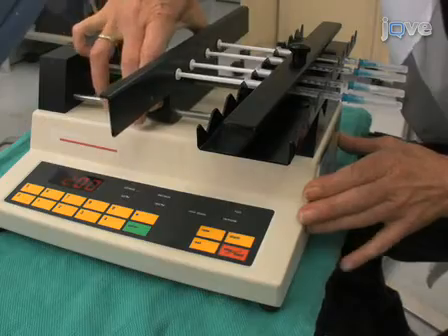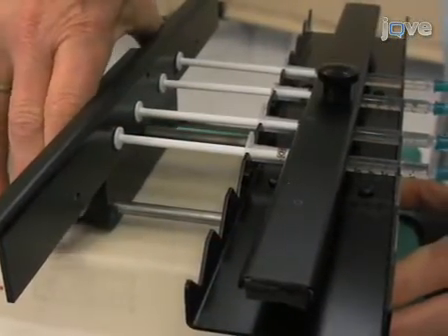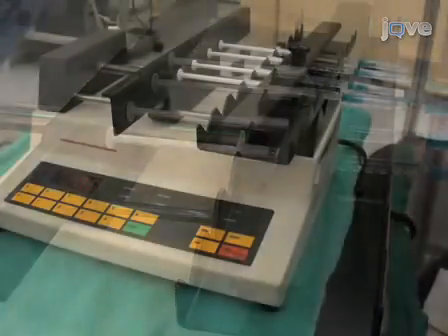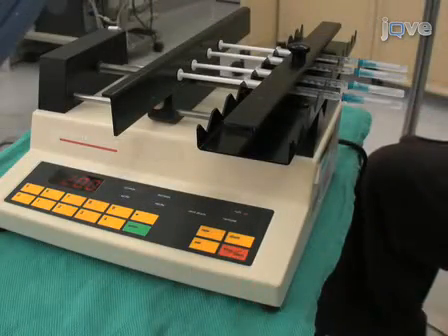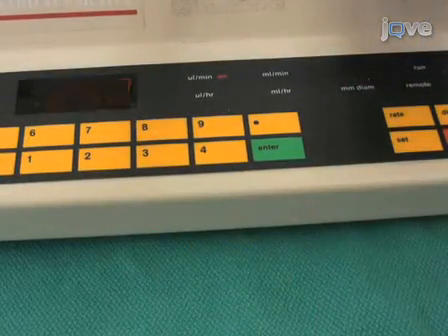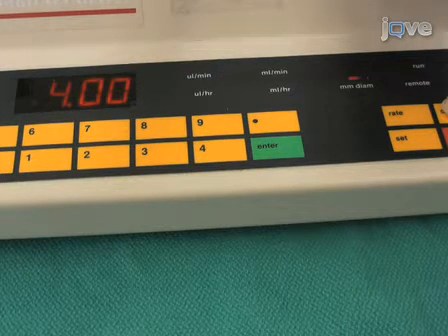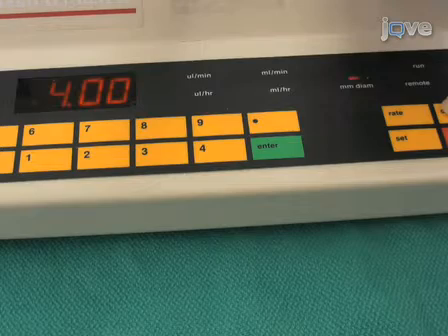Make certain that the bar of the infusion pump driving the syringe is in full contact with the plunger of the syringe. Set the pump rate after confirming that the syringe diameter has been accurately entered into the pump. Commonly used infusion rates range between 2 to 4 microliters per minute. Now you are ready to place the catheter.